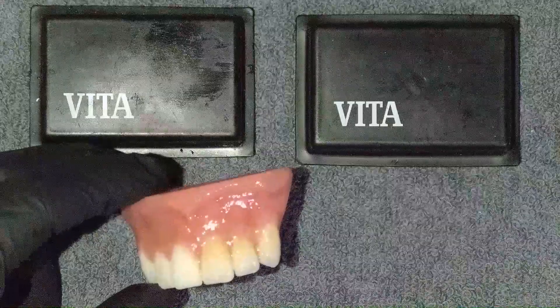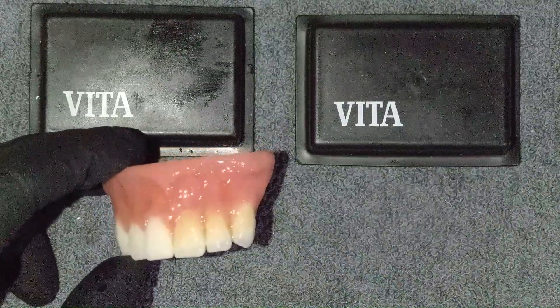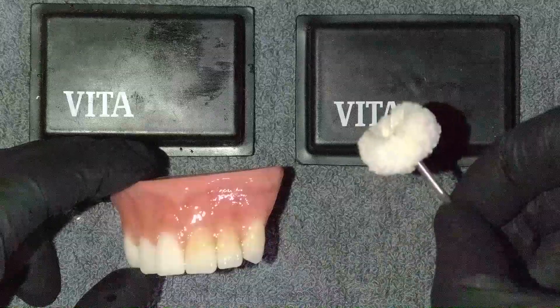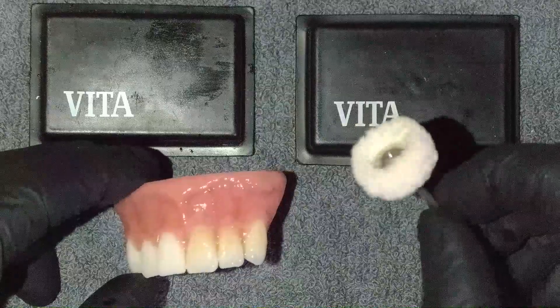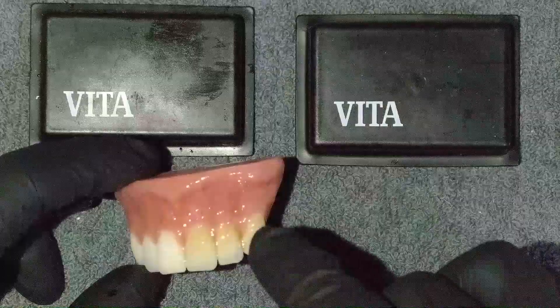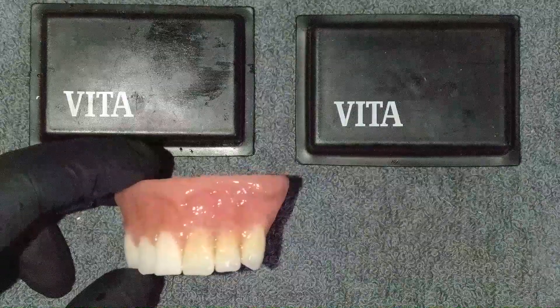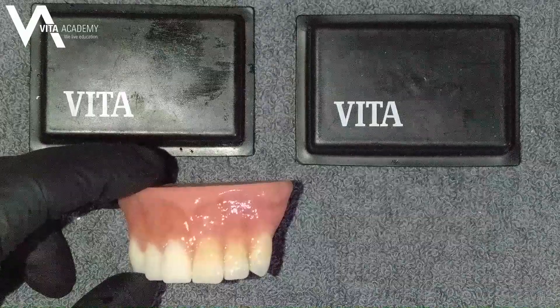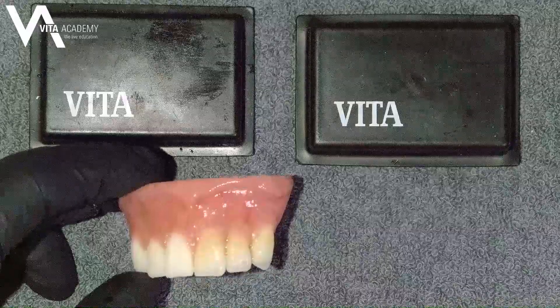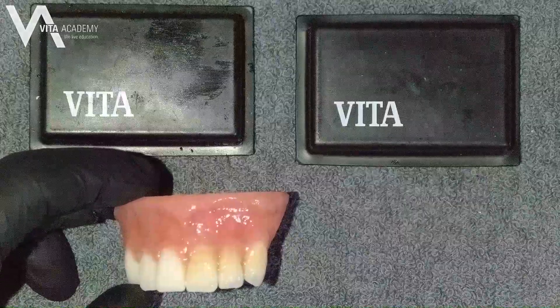One more trick that Julian taught me: after you've done the final glaze and cured it completely, if you take a small buffing wheel and go very slowly and very lightly across the surface, it will give the glaze a kind of high shine and really make it pop — it looks amazing. Hopefully that has given you guys a good place to start and answered some of your questions. Please contact us at Vita North America or check out our Vita North America YouTube page for other videos and techniques. Thanks a lot, and have a great day.